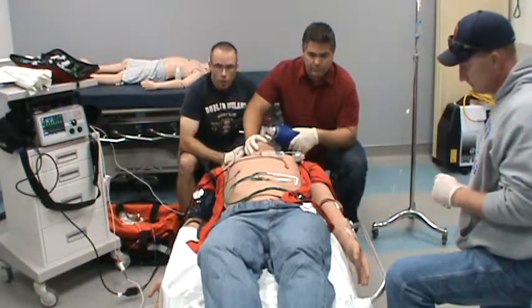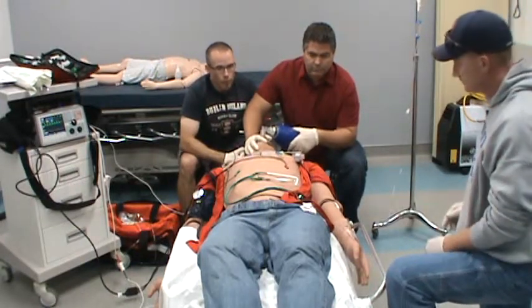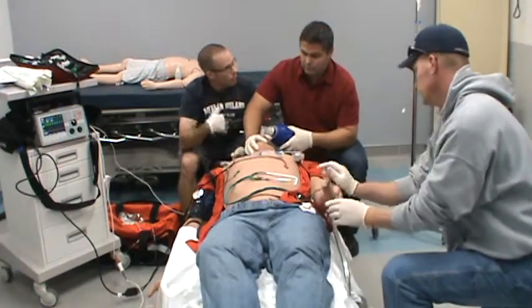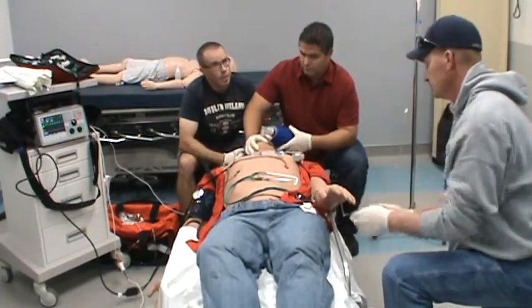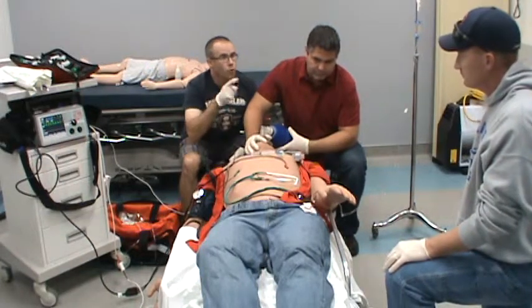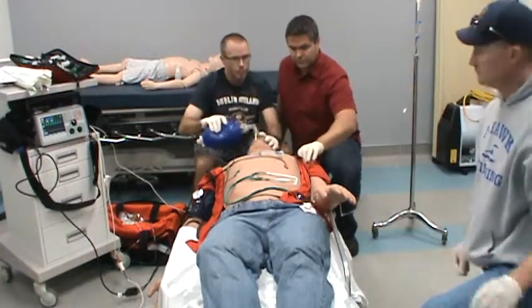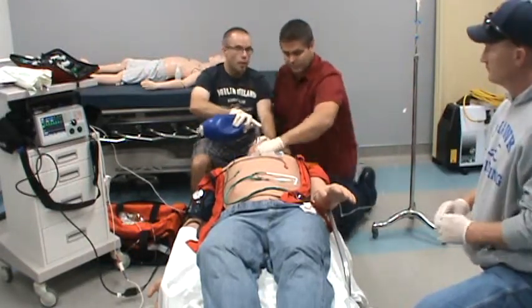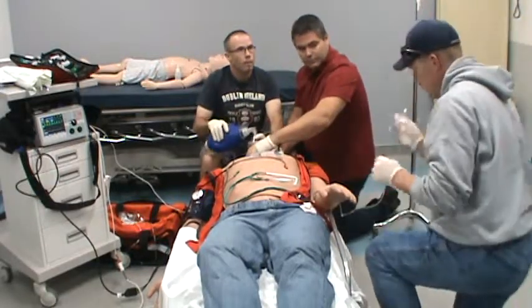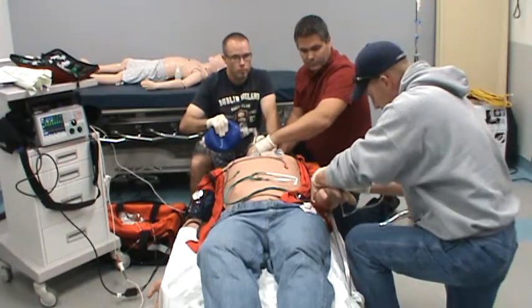Okay. Great. I will give you the time frames on when to give it. Remember, they're all IV push. And at this time, we confirmed that there were no contraindications to succinylcholine. So let's go ahead. I'll take over the bagging for right now. You go ahead and start some crike pressure for me. And go ahead and give the ketamine. Okay, ketamine, I've got taped to the syringe I have drawn up. All right. You put in 2 mLs, which is 200.